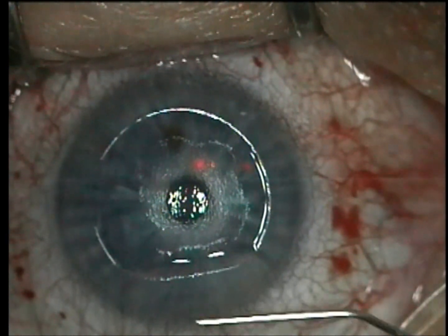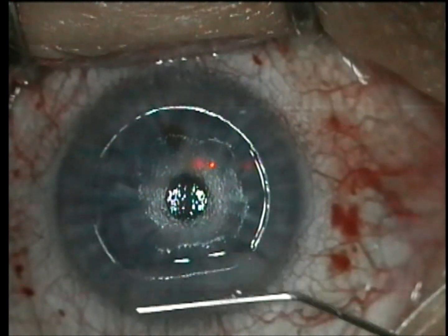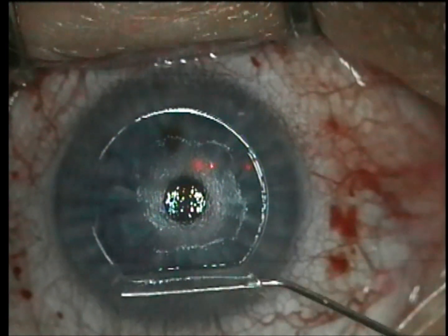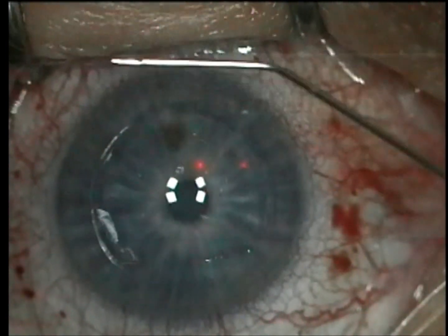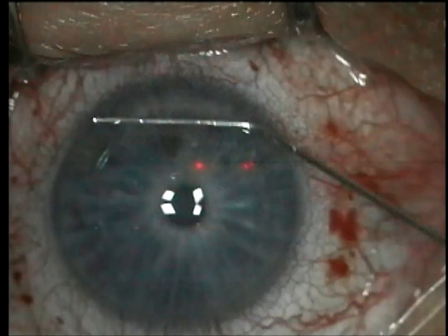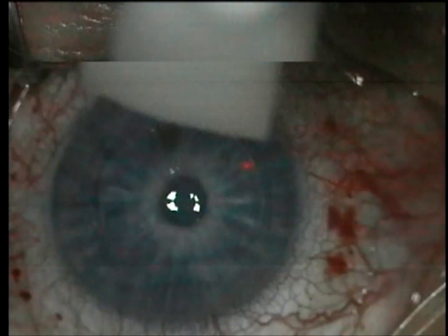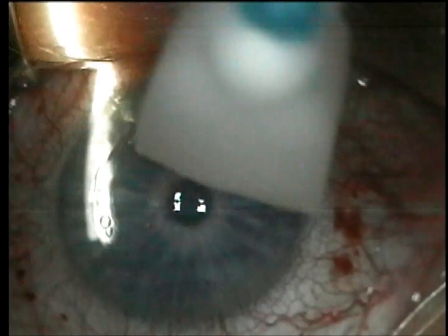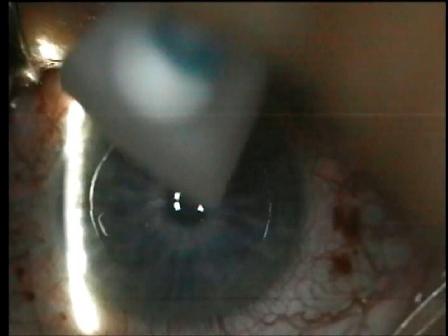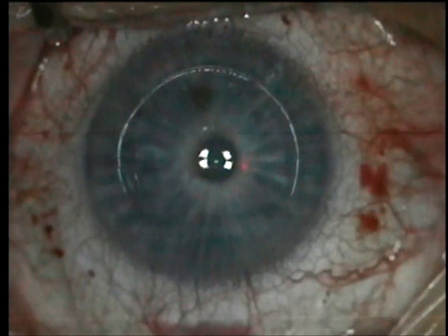I'm looking for that dimpling down of the flap — that peau d'orange look like the skin of an orange — and I now know that it's stuck down well. I'll go under the flap and flip it back in place. Then what I like to do is go under the flap, lift up over the inlay, and irrigate and sweep out. I really think this leads to a much smoother, clearer flap. You can't irrigate right down on the inlay or you'll irrigate it out of the bed.